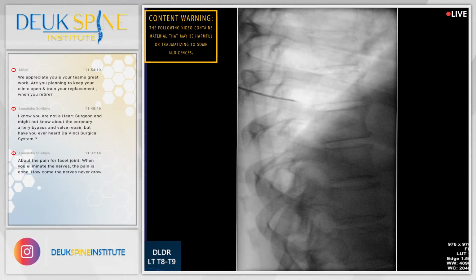How else could I change this trajectory? I guess I could try a little bit south, coming from below a little bit, and see, since I can't get there from the other place, I'm going to try coming one just underneath. Maybe that'll allow me.